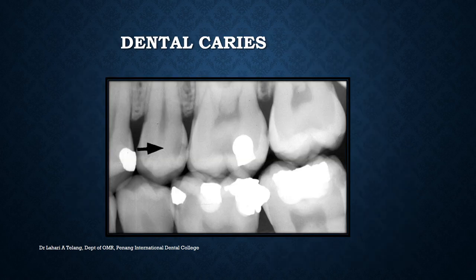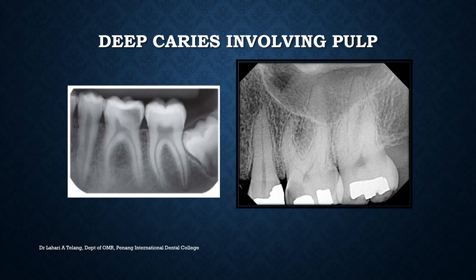Looking at dental caries — in this bitewing radiograph, on the proximal and distal surface of what is probably the left premolar or molar, you can see a radiolucency involving the enamel and dentine, which looks like dental caries. When looking at deep caries involving the pulp, it involves considerable enamel, dentine, and is very close to the pulp horn. The depth of caries and proximity to the pulp is how you analyze severity.